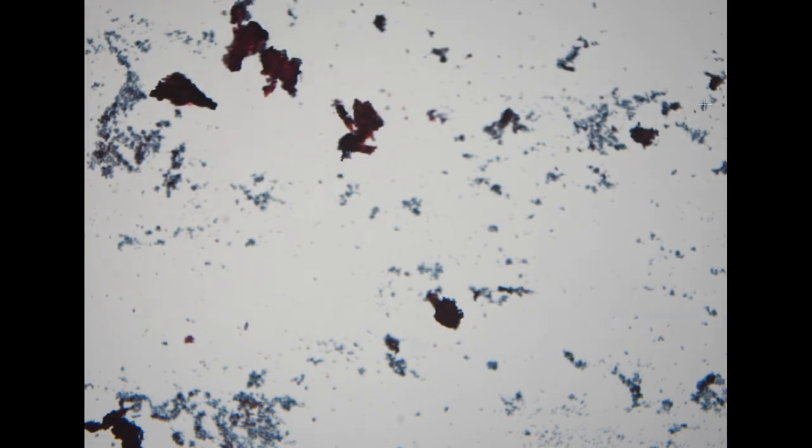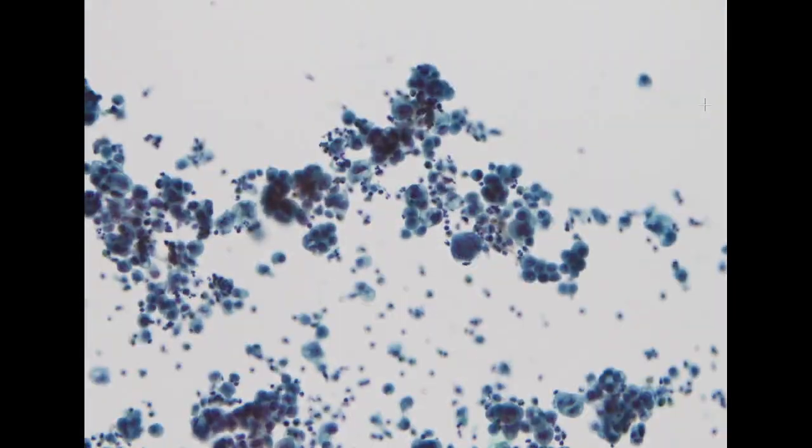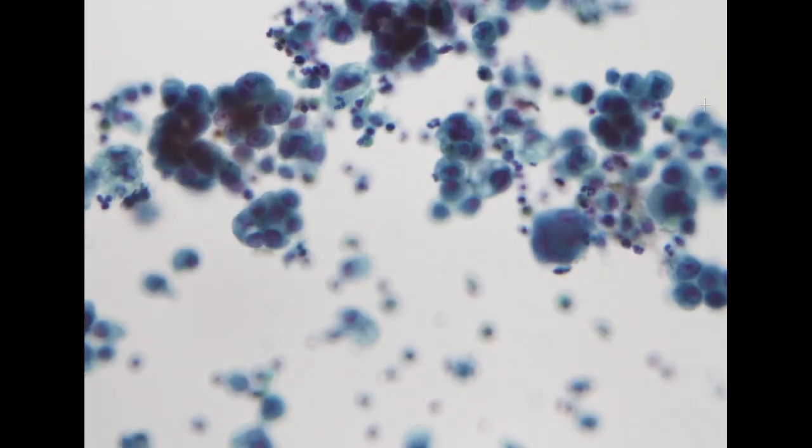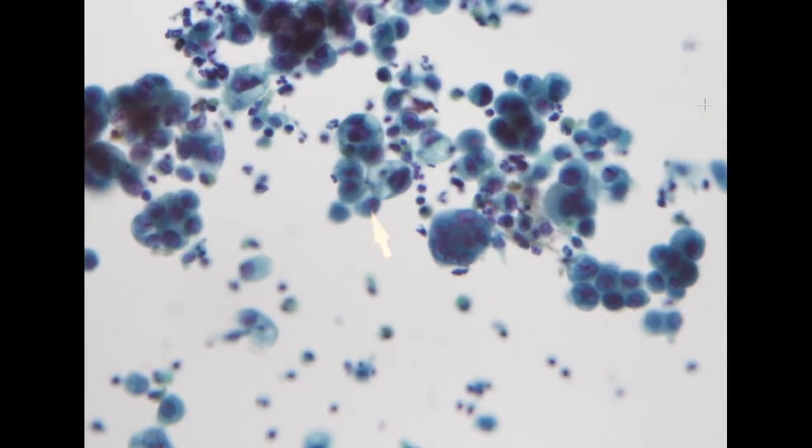The next one is a new patient, also pleural effusion. It's from a 74-year-old male who presented at our emergency department. So in this specimen, we see quite some inflammation, but a lot of cells appear to be malignant and look like adenocarcinoma.